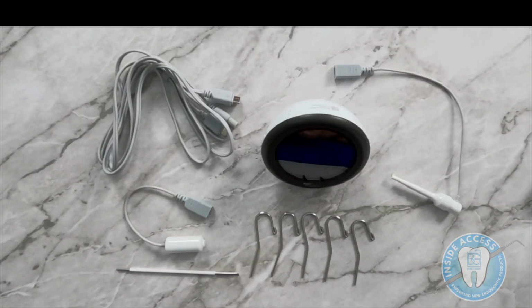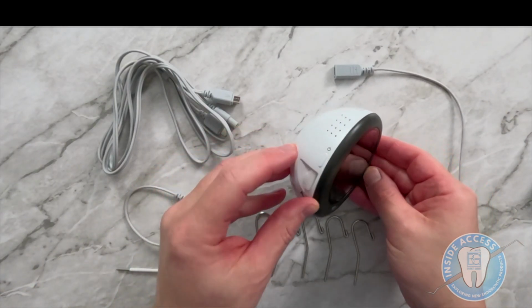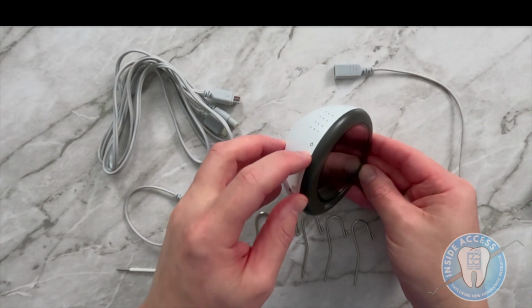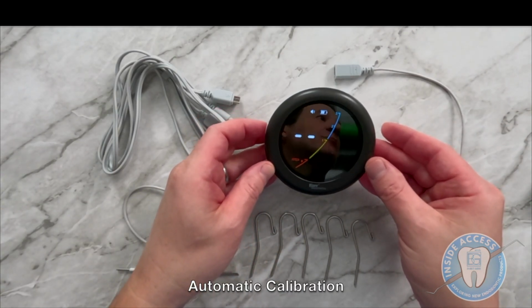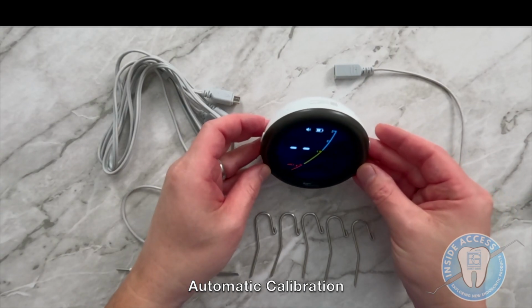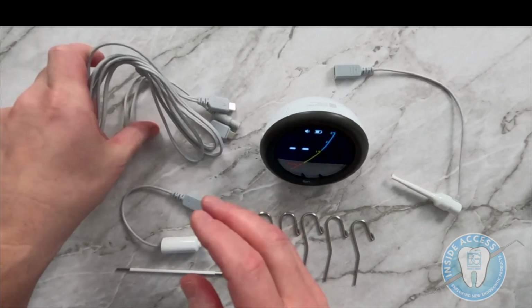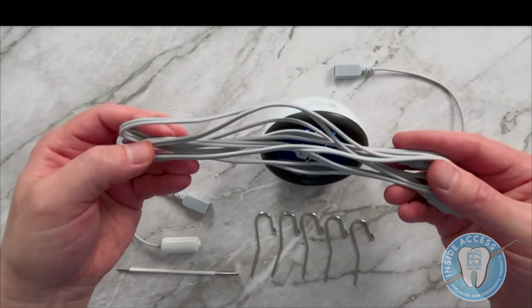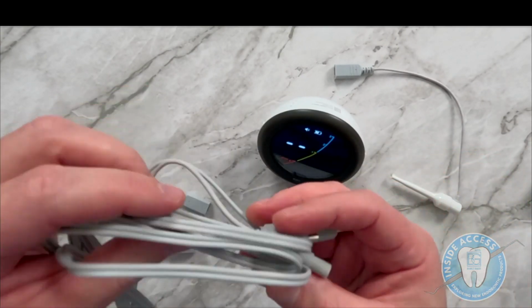The Apex Connect has a number of different features, and I want to show you the components. First and foremost, we can power it on with this left button. When we do, you're going to see the CAL light up. CAL means that this unit auto-calibrates, so it's automatically calibrated right out of the box. They've included a 5-foot lead cord. It's a little bit thicker than what we've typically seen with other apex locators.